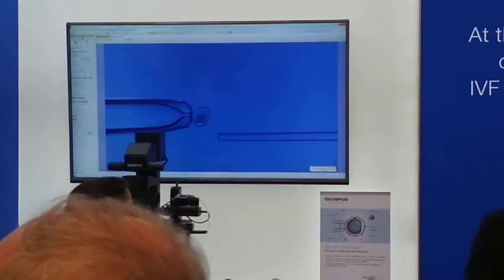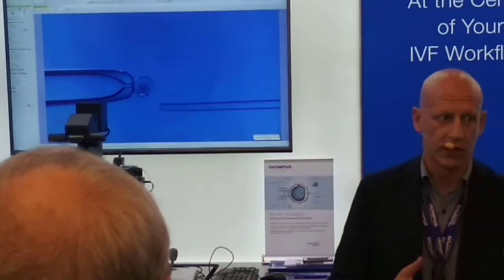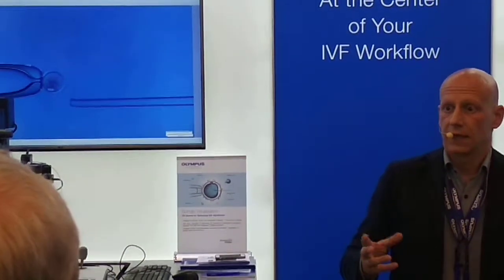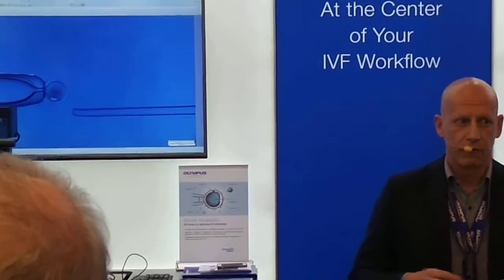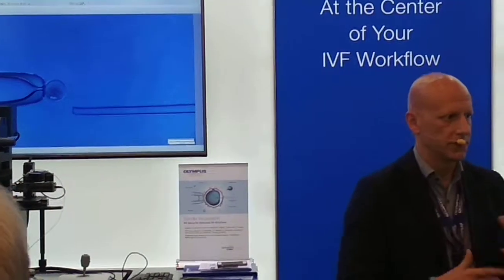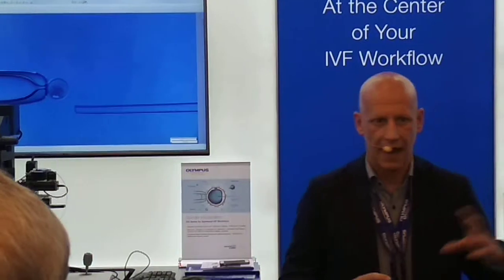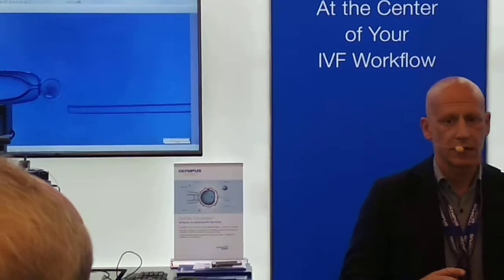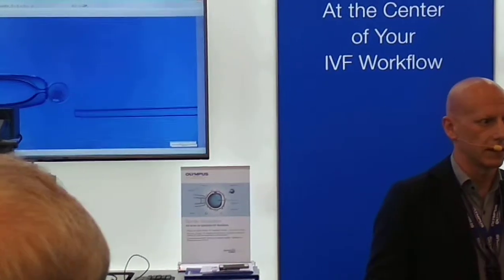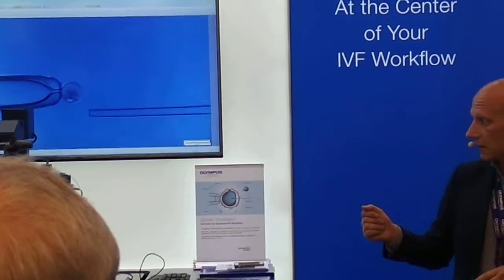With just one button, we switch from relief contrast, from Hoffman observation, so the normal contrast that you are used to working with, up to polarization. And this is done in a very easy way. If you have worked with polarization in the past, maybe you remember that it was somewhat difficult to get an image. You needed to go through a camera and a software. In this case, it's pure optics, pure microscopy. So we have a live image under the microscope. We don't even need a camera. We can see the spindles down on the microscope.